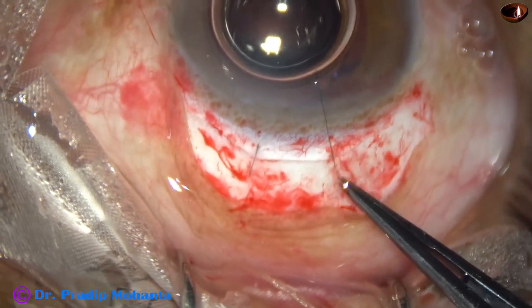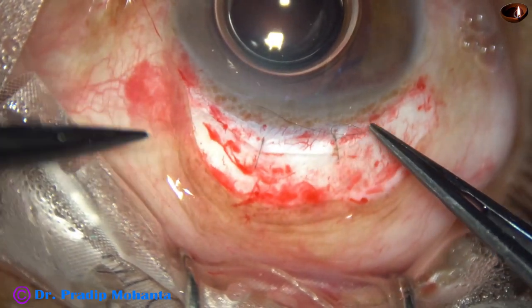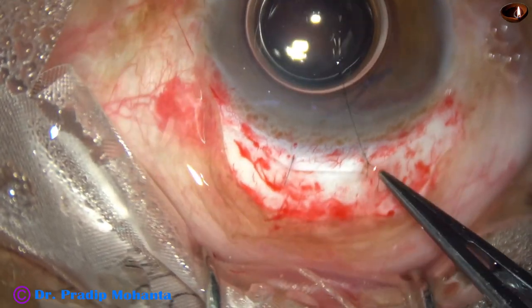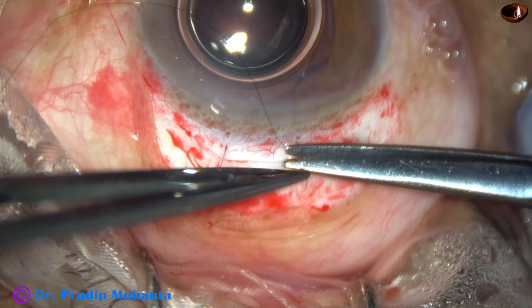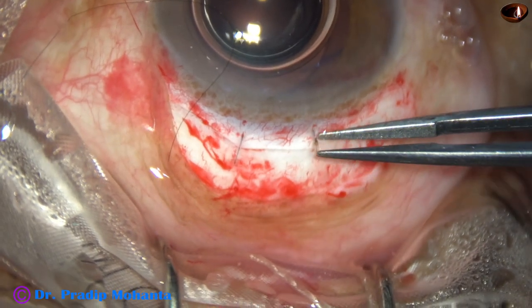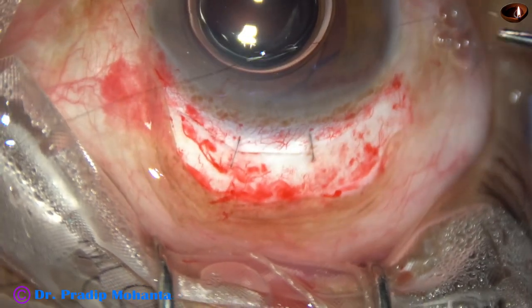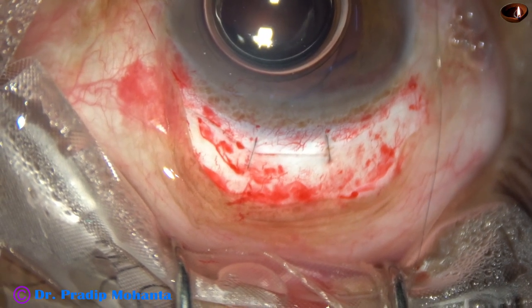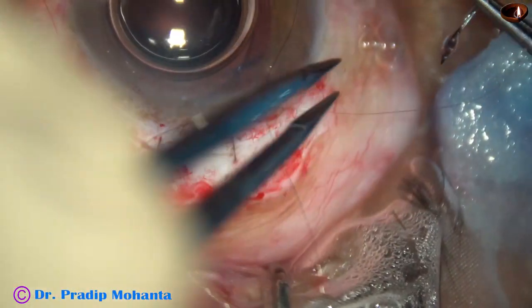So this is two loops. This is one more and there's another one. So this is another two-loop interrupted suture. The threads are trimmed and then the knot is buried into the sclera. Though this is a large wound, there will be no astigmatism or minimal astigmatism because of these two sutures.